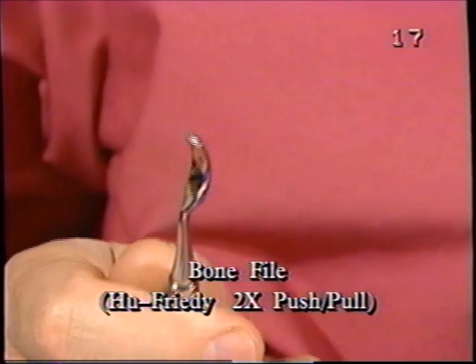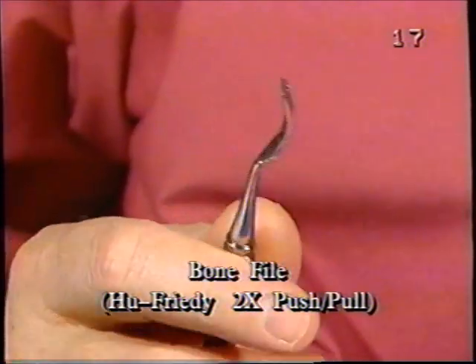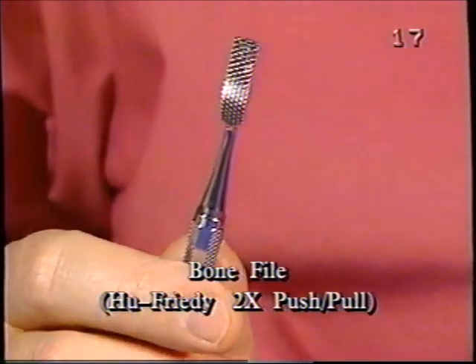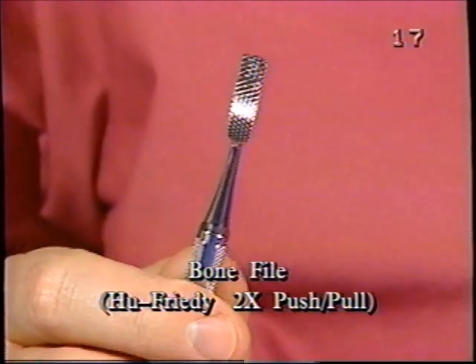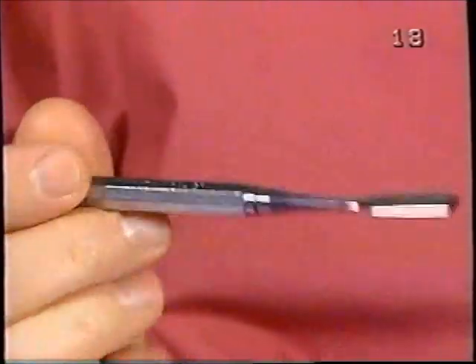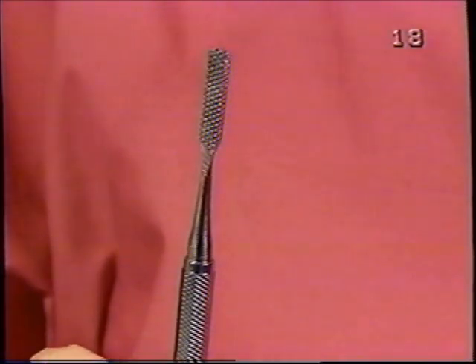Now, as far as supplemental instruments go, let's look at a few things that help smooth bone, particularly during alveoplasties. First one is the bone file, and this is a 2X, both push or pull, rounded on one side and then flat on the other. Another instrument for dealing with bone, be it torus removal or alveoplasty.